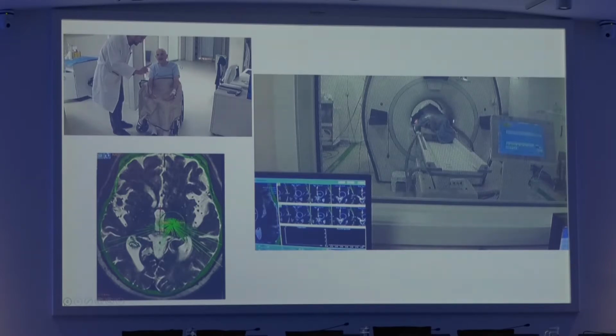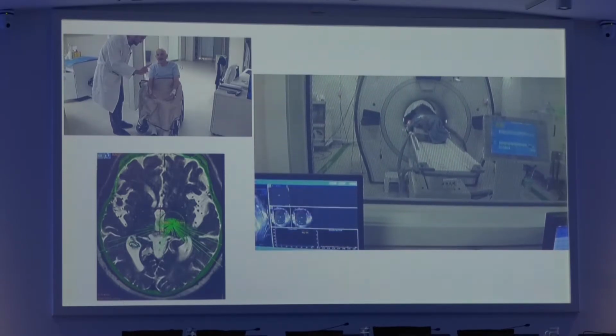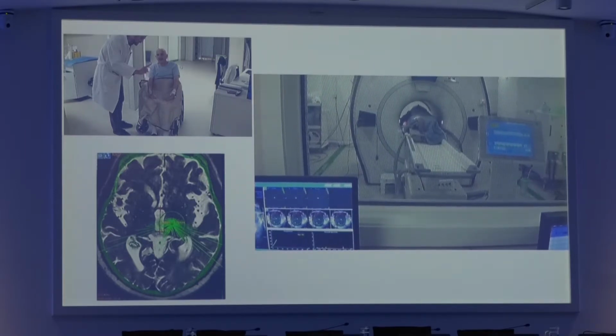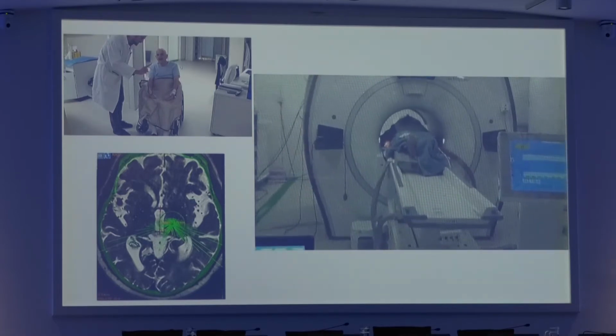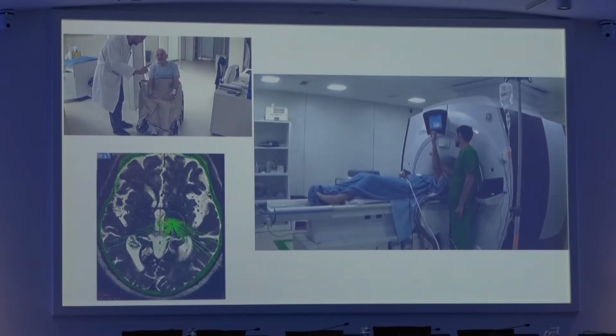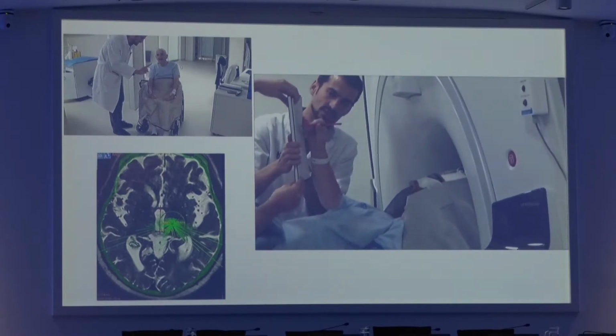And once we know that we are in this target, that we are well placed, we start with sonications. Take a look at this hand, okay? It will be shaking when I start the video. And then look also here when the temperature curve will start rising, okay? So we start delivering energy, the patient is shaking, temperature starts increasing, pam, pam, and tremor stops. Okay, so this is an effective sonication. We have increased the temperature at that nucleus, and after that, we can assess the patient all the time. We can go in and out of the MRI, and this is a very well controlled manner of doing a lesion. We can even do tasks or whatever.